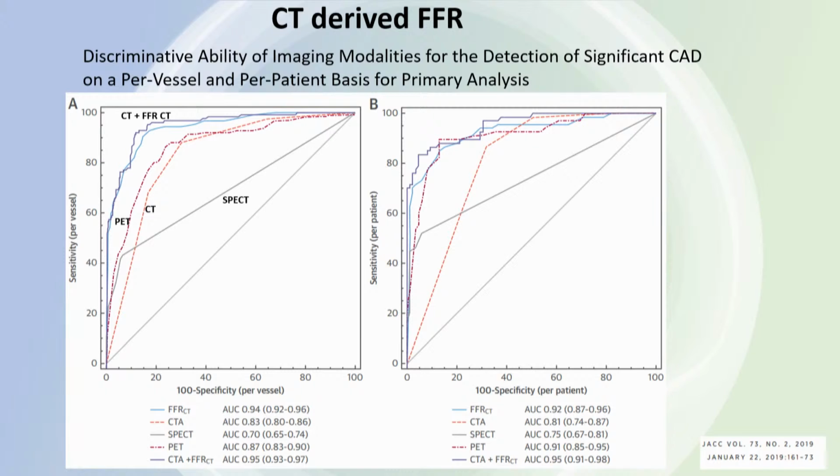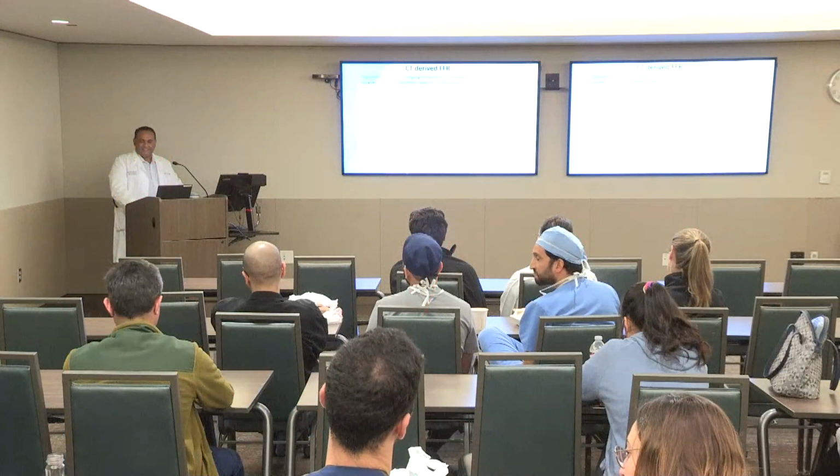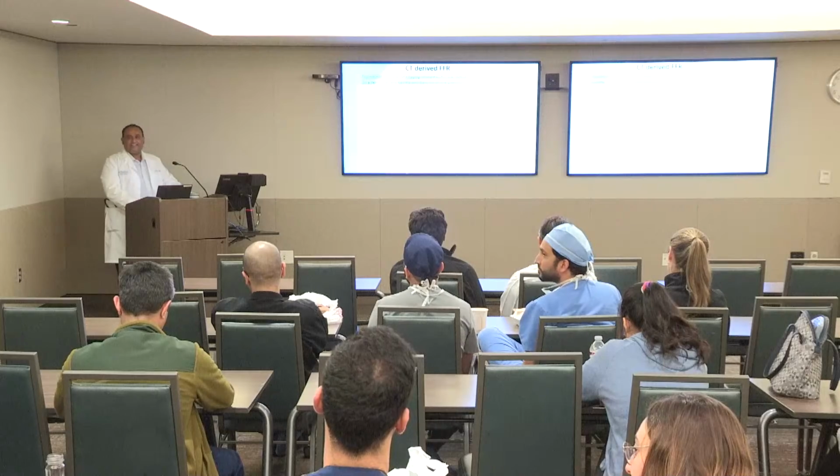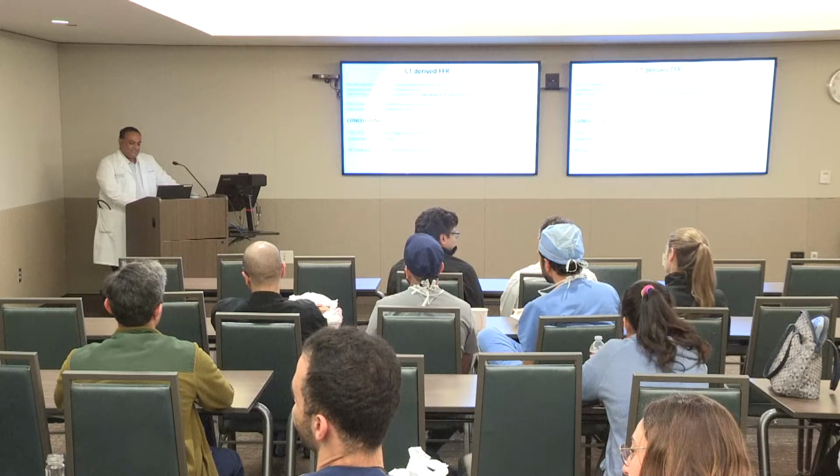They could only process about 150 cases on CT for CT FFR. So the entire study had 208 patients, and they could only process 150. Yes. So when you do intention to diagnose, then PET was clearly a winner. And this is PET with oxygen-15 water, so this is only the flow portion.